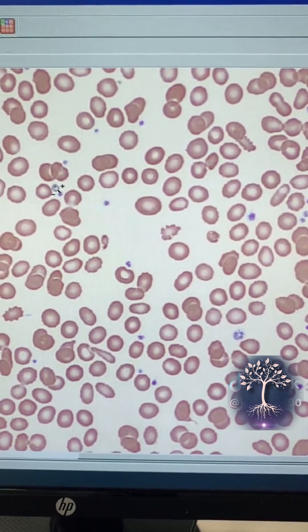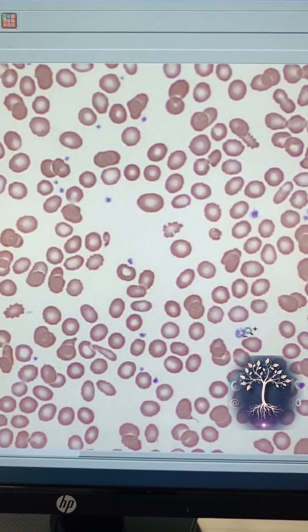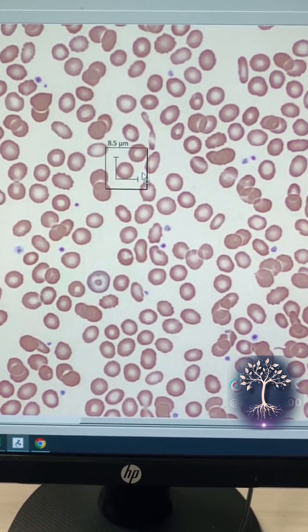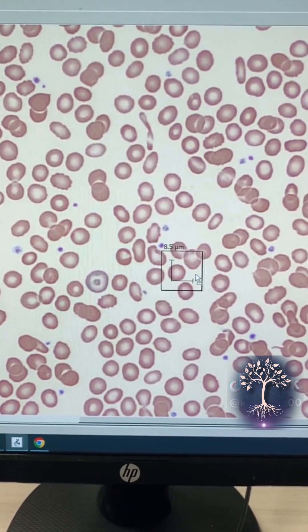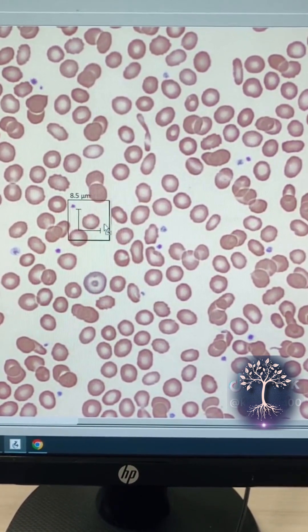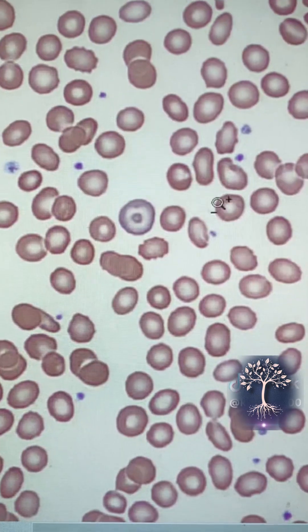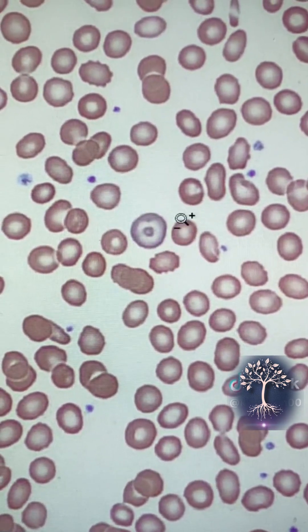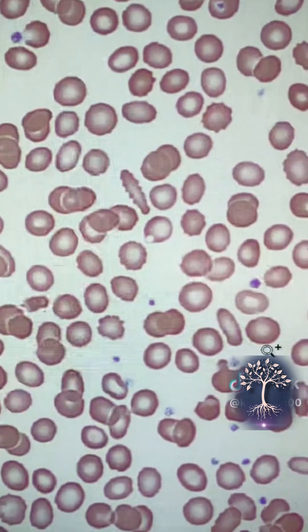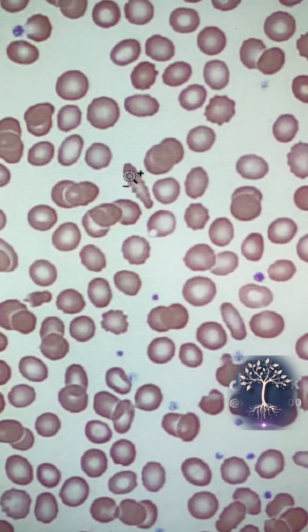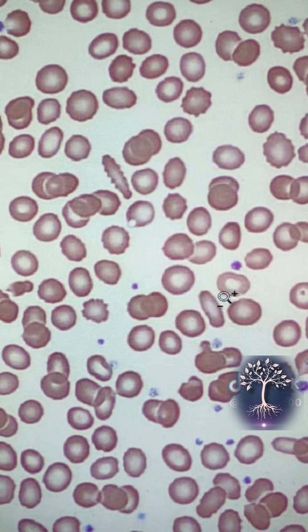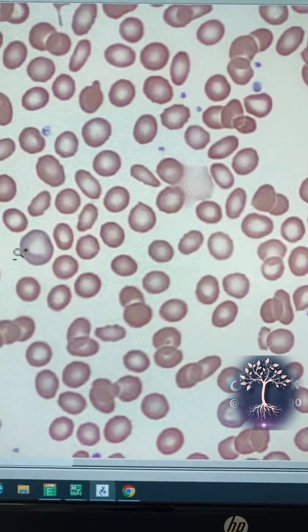The red structures are red blood cells, and these little purple dots where my mouse is are your platelets. As you can see, this patient has a little bit of a wild morphology of red blood cells. This is a patient I would call microcytes on because the red blood cells are so tiny. This little square shows the size of your average red blood cell, and this patient's red blood cells are kind of small. We also have some polychromasia, some anisocytosis. This cell here is a target cell — you can see how it looks like a target or a bullseye. We have a cell here that looks like a cigar, kind of elongated. This is an elliptocyte. Then we also have some crenated blood cells here, some acanthocytes. This patient has some pretty cool morphology.